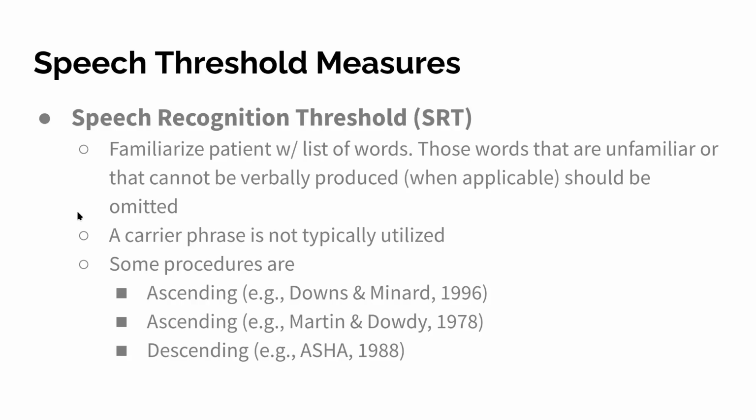A carrier phrase is not typically utilized. I haven't really mentioned what a carrier phrase is. That's like, say the word hot dog, say the word baseball. We don't usually use a carrier phrase. We just say hot dog, baseball, airplane.